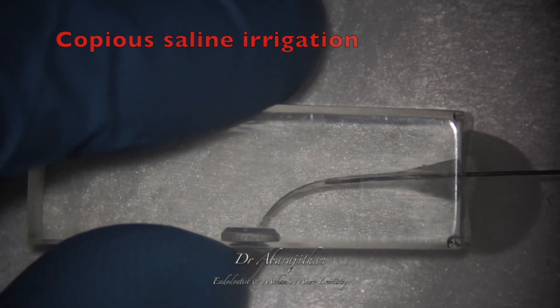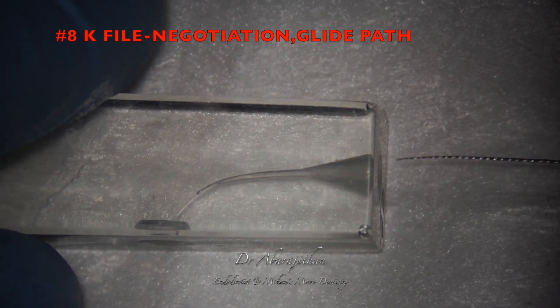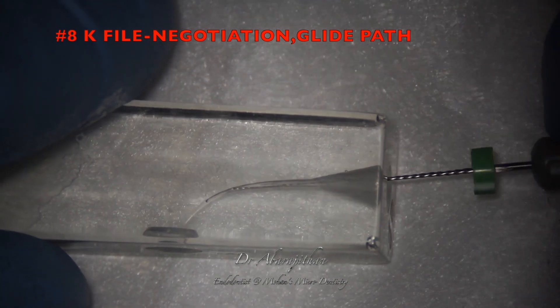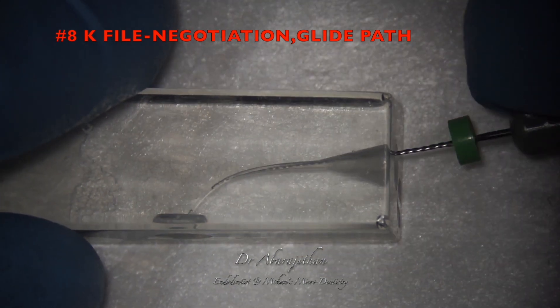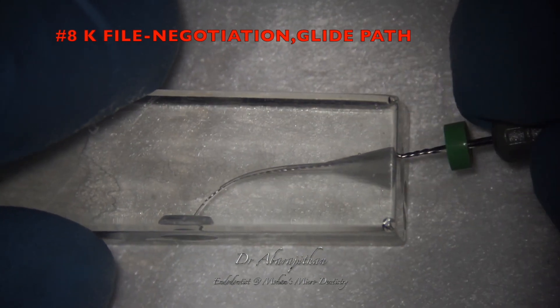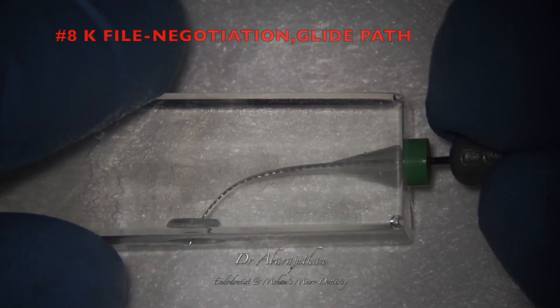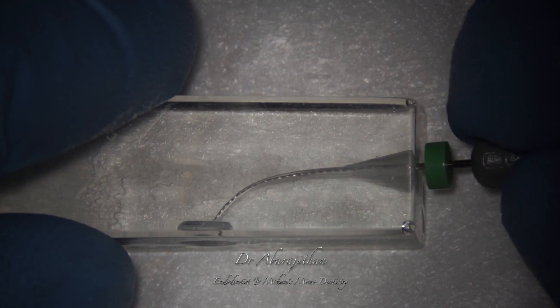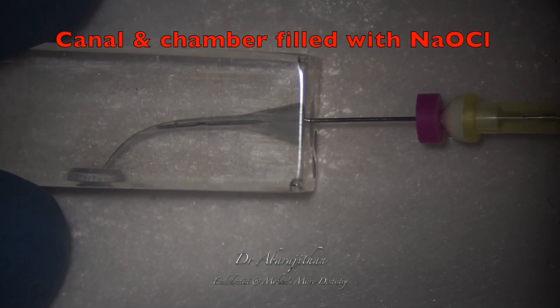So we don't force the file here. We stop, irrigate with saline again. Just like in situation 1, now we try to negotiate the canal with an 8 size K file — first establishing patency in a watch winding motion, following which we check the glide path with gentle up-and-down motion.